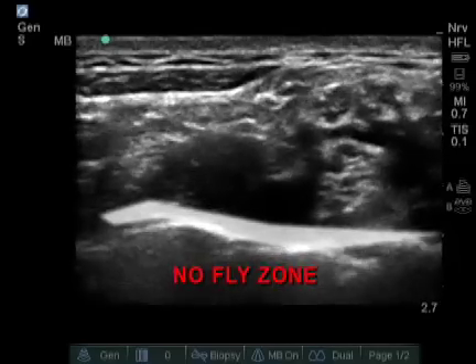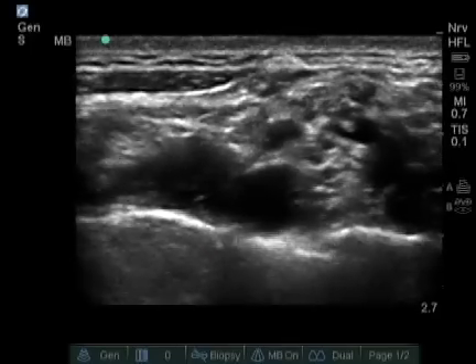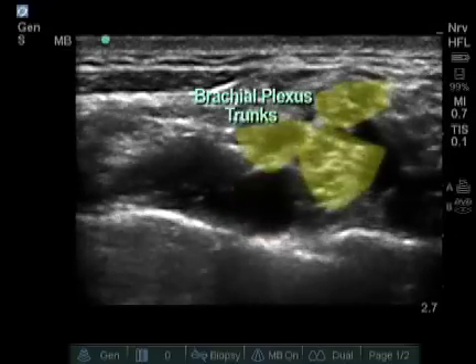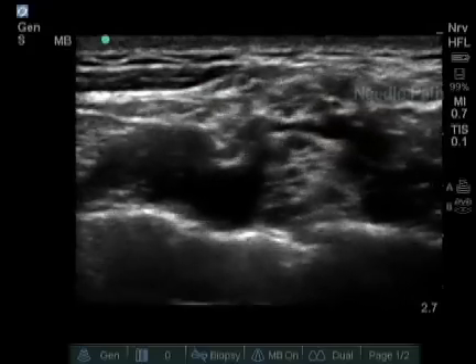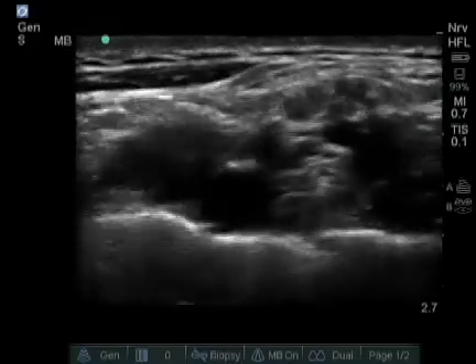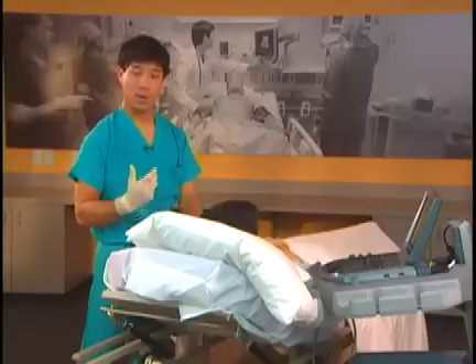We call the area below this stripe the no-fly zone. On the screen, we now see from left to right the anterior scalene on the left and the pulsating subclavian artery. The most important place to make sure you have local anesthetic is between the pulsating subclavian artery and the first rib. This is because the inferior trunk lies in this area, and some people have difficulty with the supraclavicular block because it is ulnar sparing.